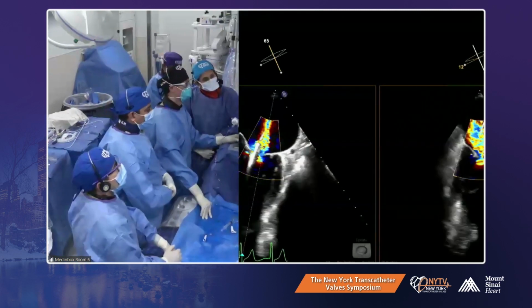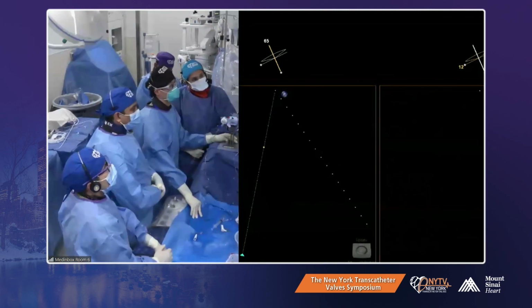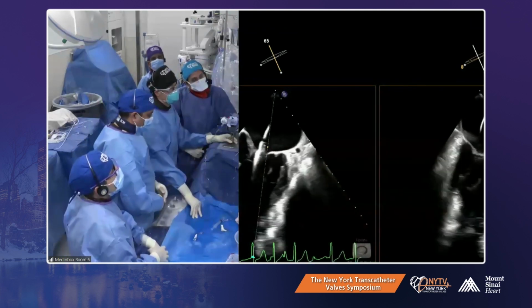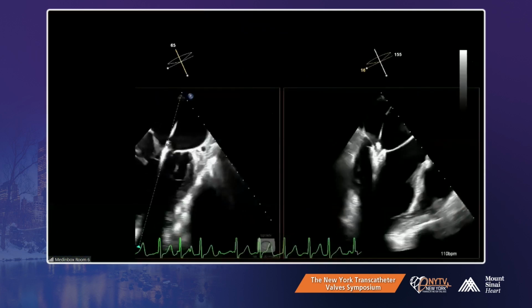Well, we should have a lot of stored tension here, so we'll have the second clip. It's still moderate. That might relax a little bit. Yeah, for sure. But actually, are you happy with the insertion?